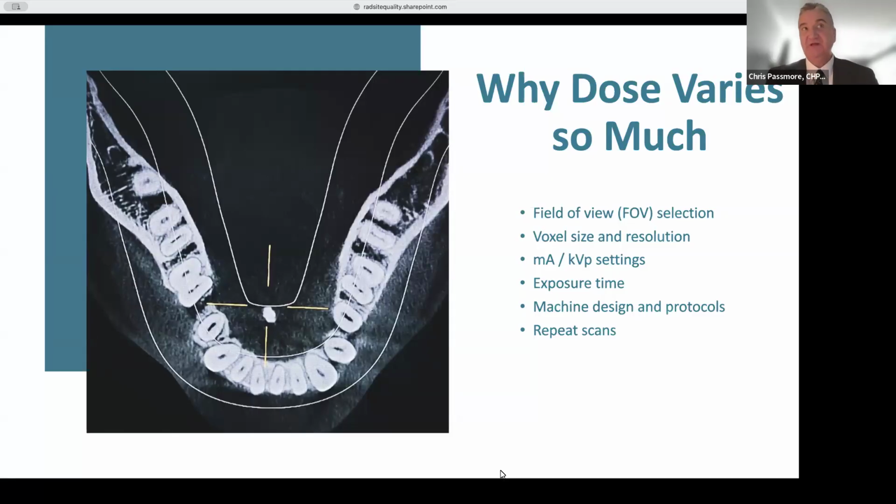Something that I like to think about sometimes is film dentistry, or film X-ray film, and then there was a move to digital. When that happened, it was noticed that when people would convert from film to digital, they would still run their systems like a film system, so they weren't getting the benefit of the digital technology in reducing the dose.